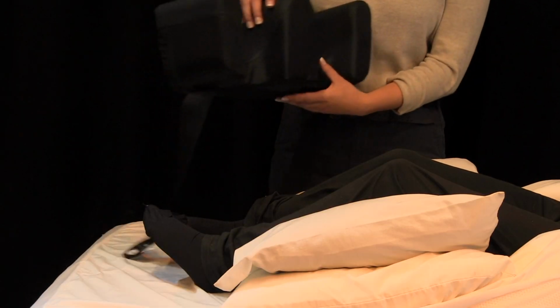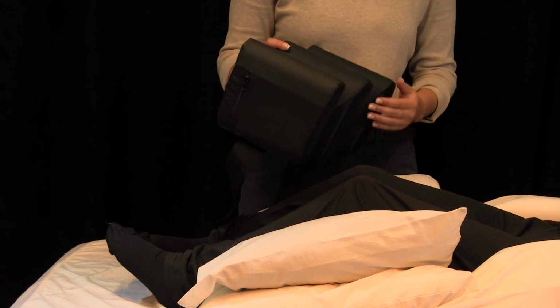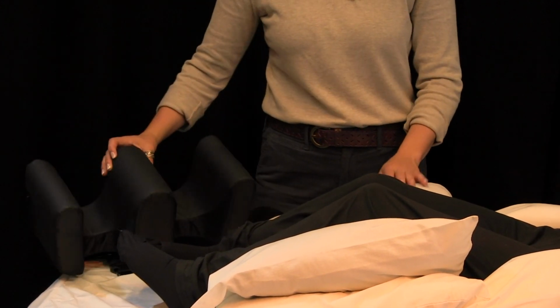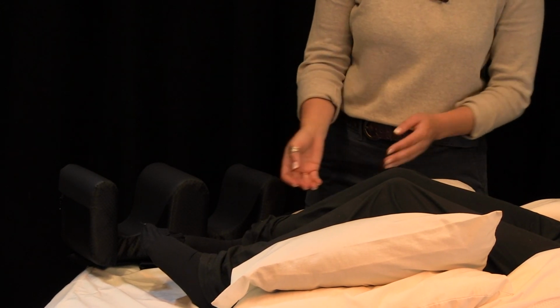So Abby, we're gonna place this between your knees and on the outside of your knees. Okay. And since there will be this extra cushion, is it okay if we take this top pillow away and see how that feels for you? Yes. Okay, sounds good. Ready? Yep.